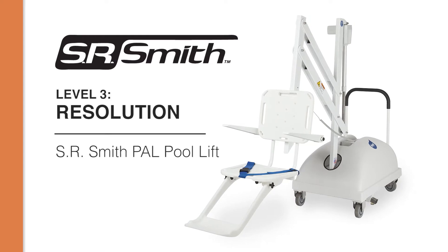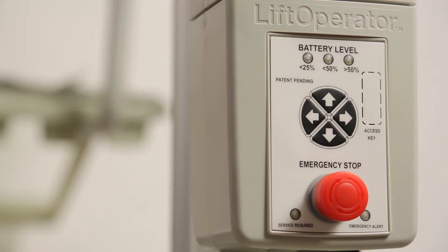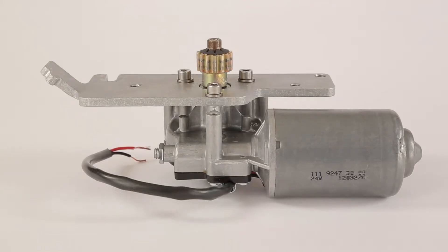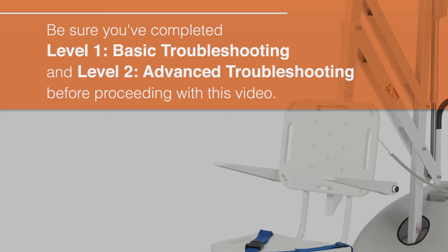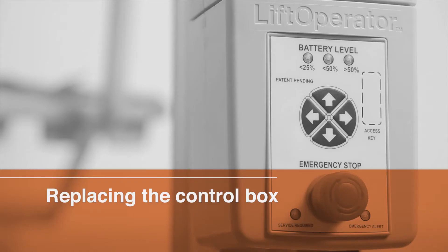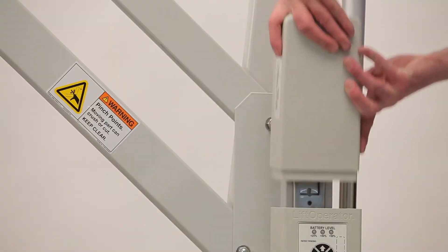In this video we will show you how to remove and replace key components in your lift. These components include the control box, the actuator, actuator cable, motor cable, motor assembly, and the gears. Please make sure you have completed the Level 1 and Level 2 videos before proceeding with this video.